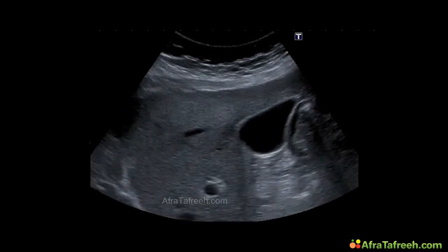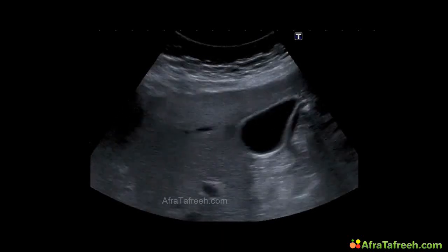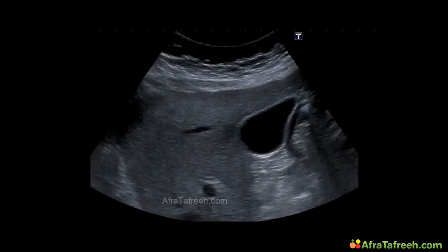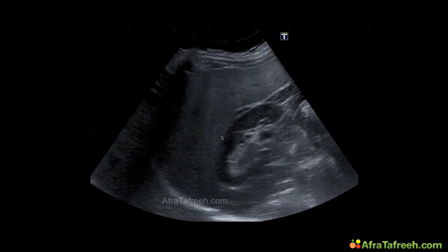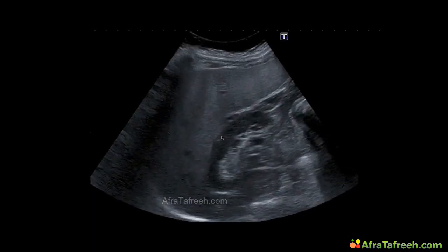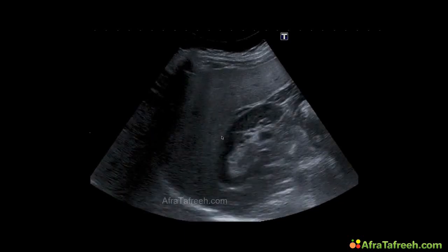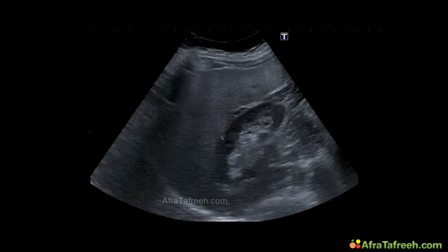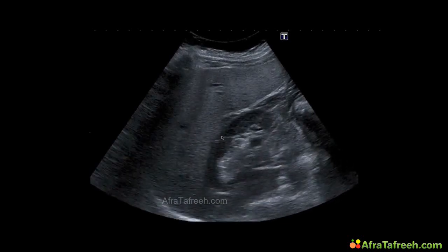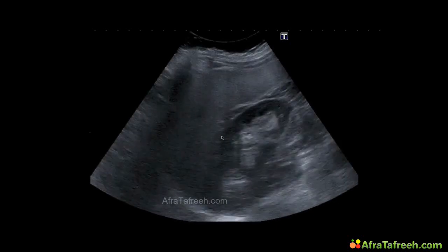Let's have this video again. Here, near the gallbladder, this focal hypoechoic area. In this video, again, we can compare the liver parenchyma to the kidney over here, to the cortex of the kidney. We see the high reflexibility and also something else.